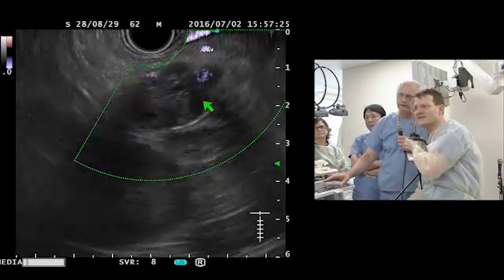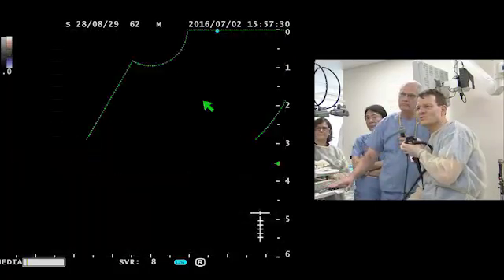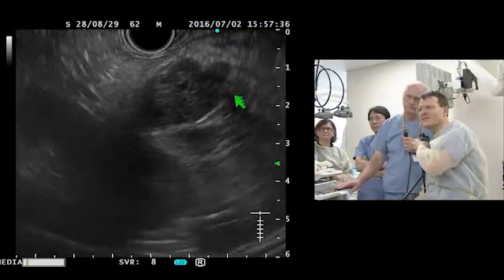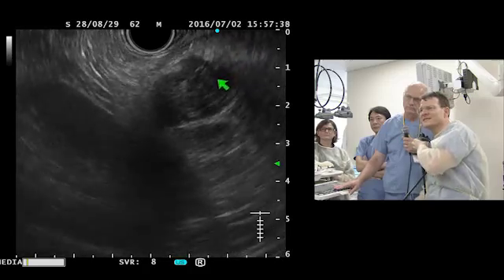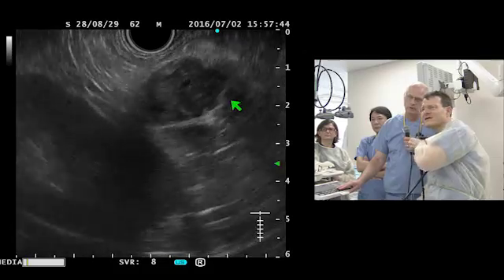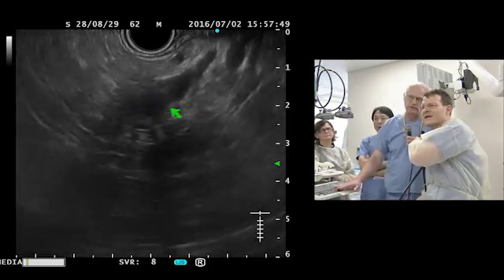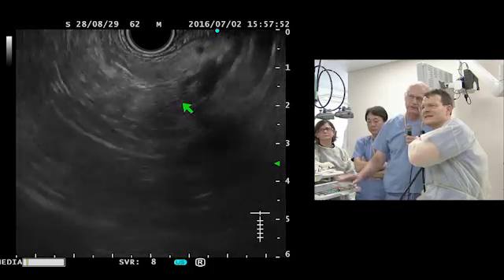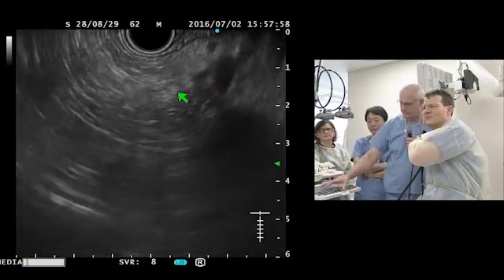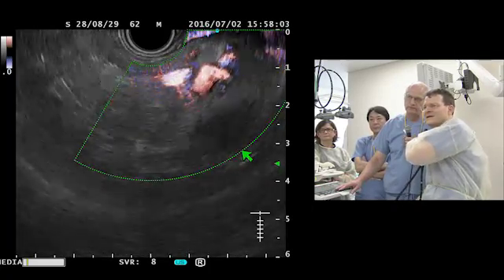This is a vessel, but actually I would love to show you also the pancreatic duct. We see here maybe the pancreatic duct in the upper part of the tumor. Why do you think that, if you see the pancreatic duct within the tumor? Is this the duct here? I suppose maybe we put some Doppler in. Just an extension of the vessel, maybe.